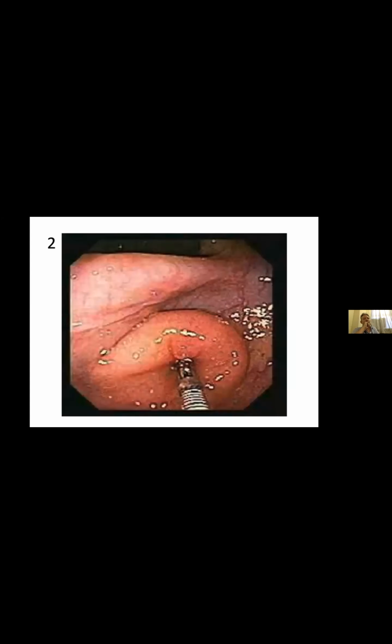It's a poor picture of this because I've pulled it off the internet. I don't have a picture of my own. But if you see a large submucosal nodule like this, and you take your biopsy forceps and push into it, and it's clearly a soft structure, that's called the pillow sign, when your biopsy pushes into it and makes a dent. That's usually a submucosal lipoma, and you can leave those alone entirely. In fact, if you do remove them, you'll probably create a perforation.